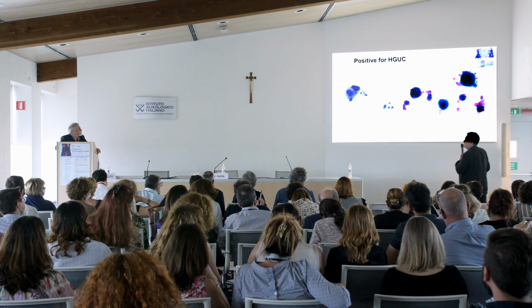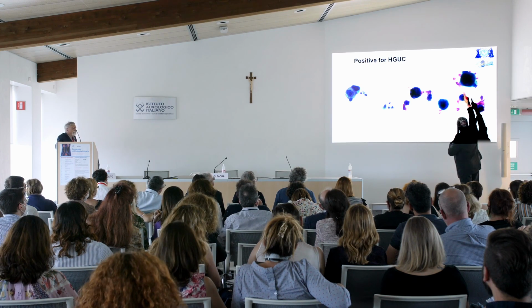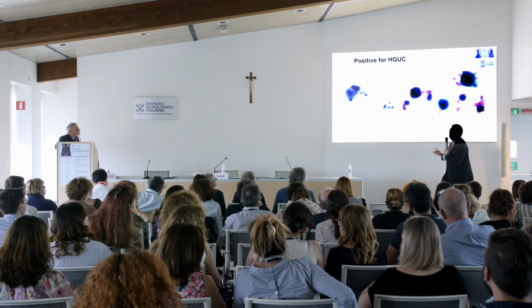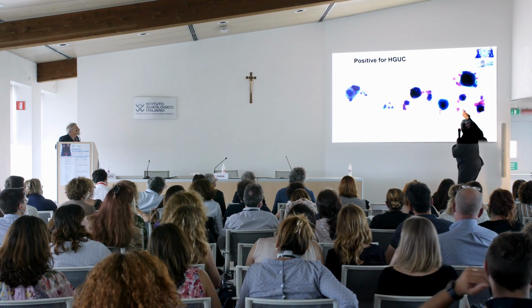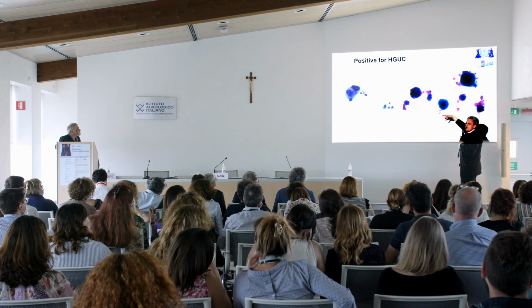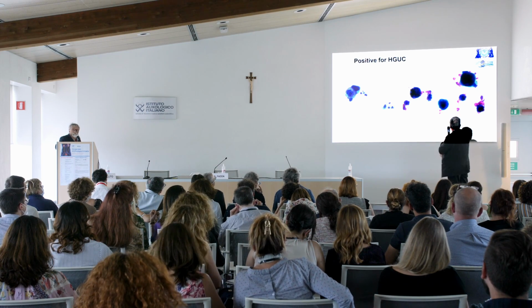Can I ask? Just let me finish. Then you have this one, which is difficult, probably the same, but a little out of focus, and again probably a nucleus undergoing a necrotic pathway.